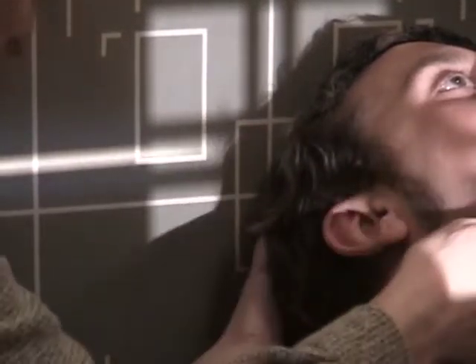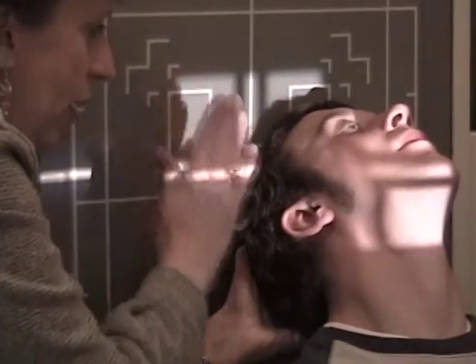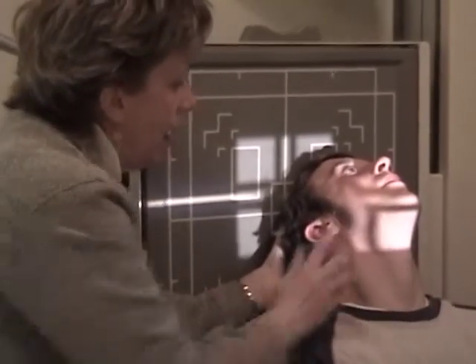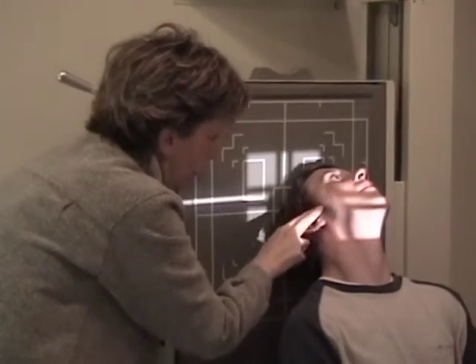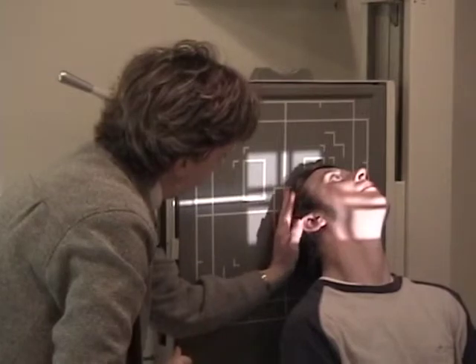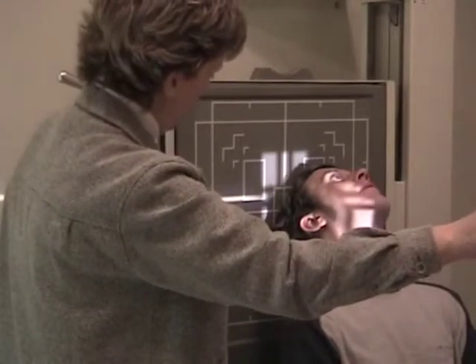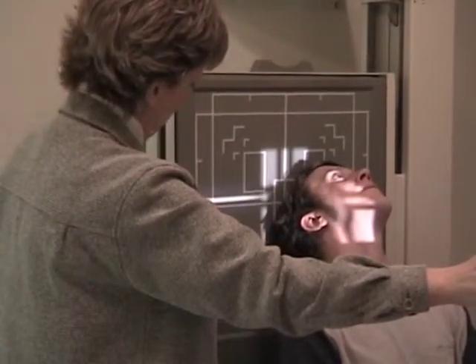Again, the infraorbital meatal line is parallel to the board. The vertex of the skull 15 degrees away, MSP turned slightly away, and that's going to open up this projection here, right here. Okay? And then you're going to center through that side. Now here we would have a right marker on. I can tighten up the collimation because we're only after one side.